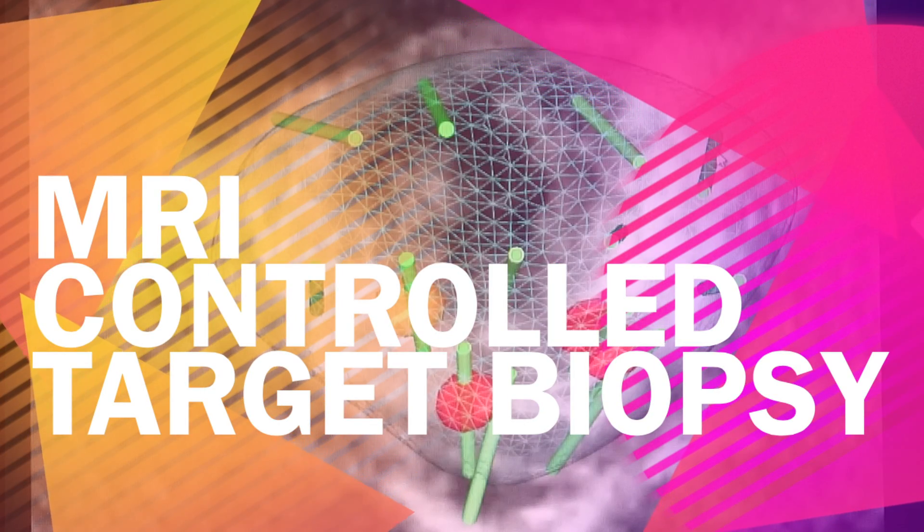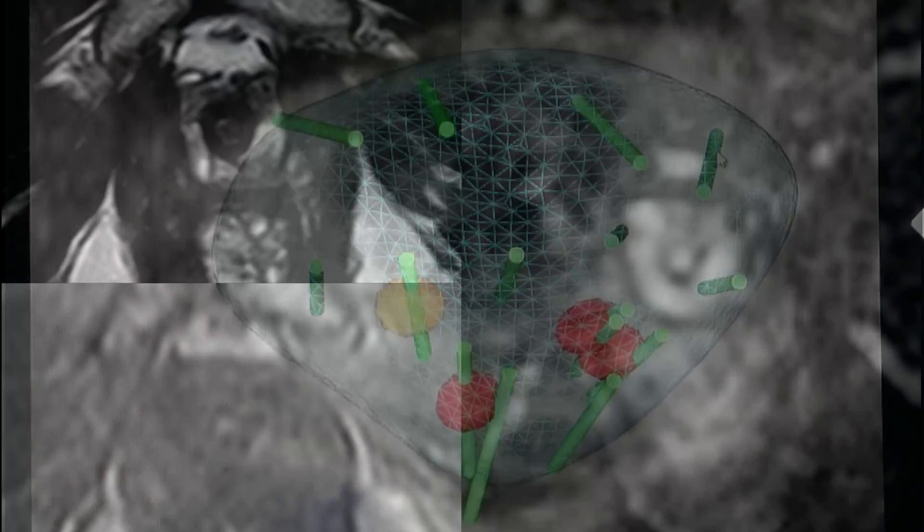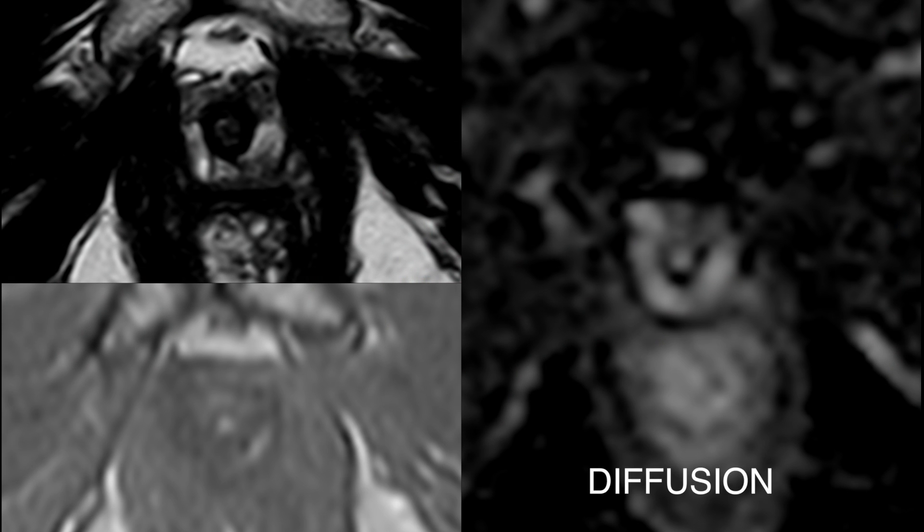The first step in our clinical practice is the multi-parametric MRI reading. MRI is always performed prior to the biopsies.